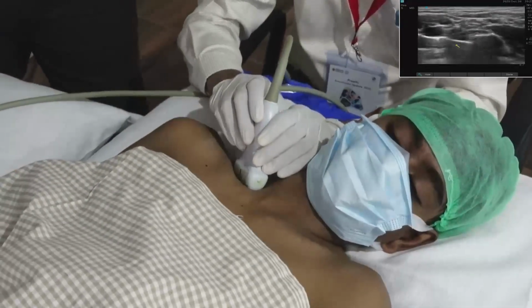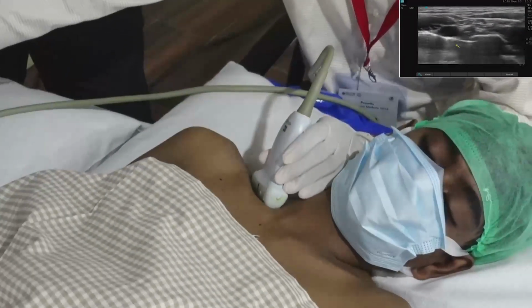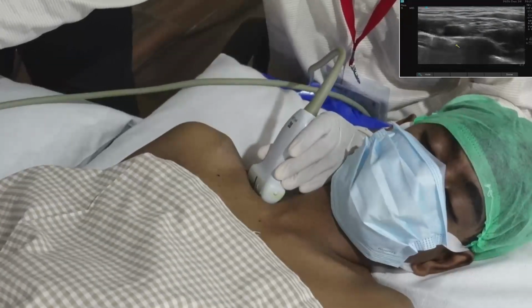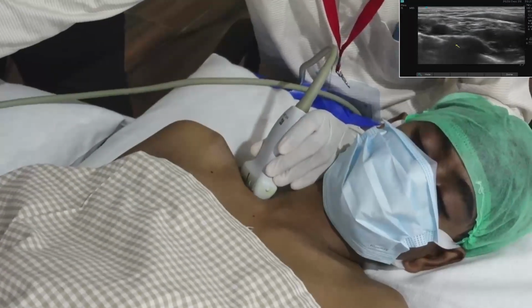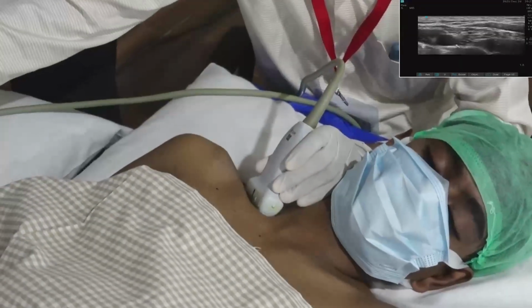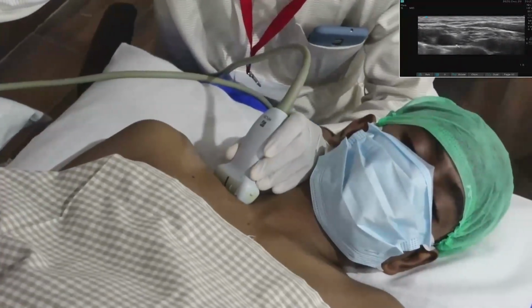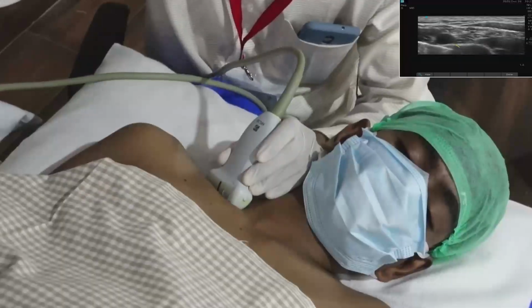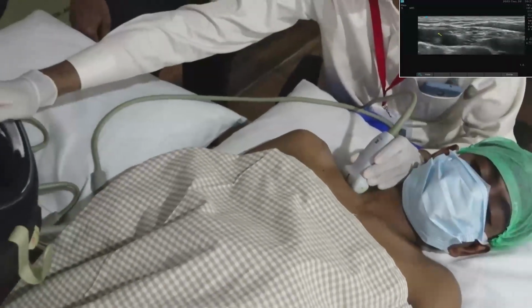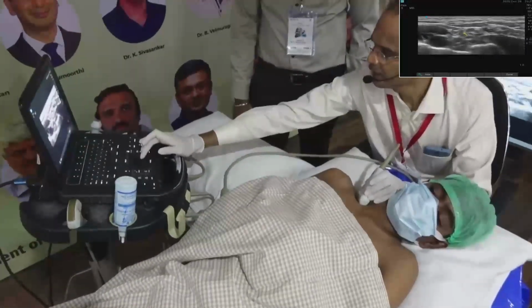Another reason is there are some anatomical variations. See, biology is very kind enough to give this very thin patient. This may not be in every case. Now we can see brachial plexus elements only over the posterolateral aspects. There are some patients who might have a brachial plexus component here also, very rarely.